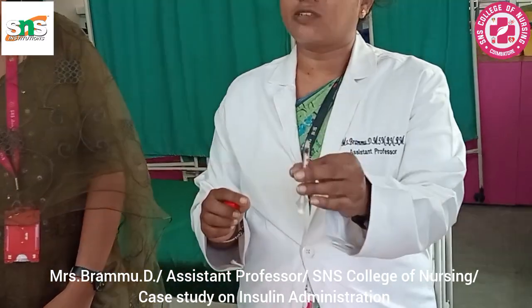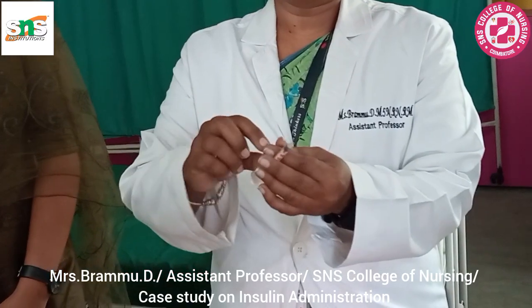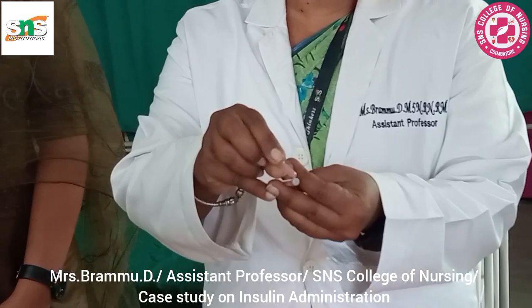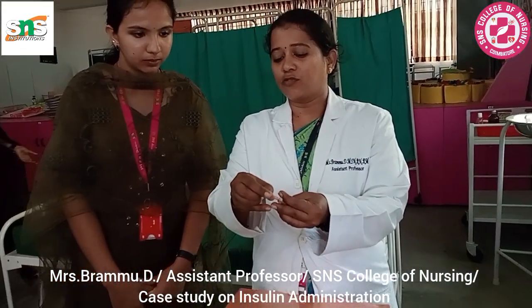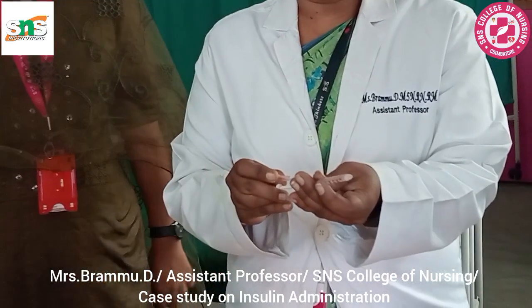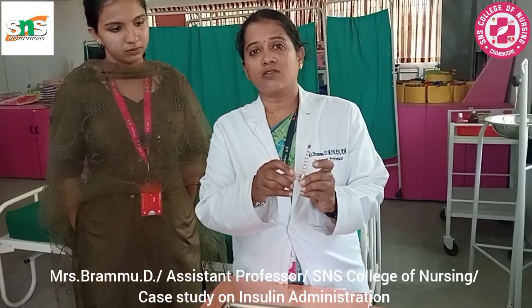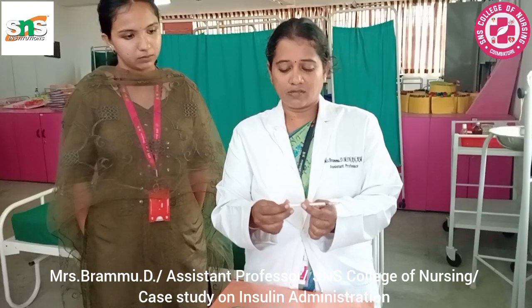Very close to the protective cap, you have the small needle which is only going to penetrate the subcutaneous layer. Followed by that, the small closed end is what we call the needle hub, and then the black portion shown over here is what we call the gasket. Then you have the plunger, with which you can load the volume as much as the doctor has ordered, and you can administer to the patient. Keep in mind, this is always expressed in units. And the other thing is the barrel, and you have the piston.